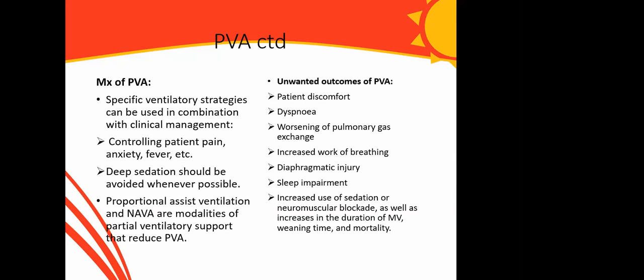and once you do that, because like we said, it could either be due to patient factor or ventilator factor. So if you deal with the patient factor, is the patient in pain, all right? Is the patient anxious? Is the patient feverish? Or is there any reason why this patient is auto-triggering or double triggering? You may want to find out, all right? And when you take care of patient's factor, you realize that you may not need too much sedation. In fact, it's been said, avoid deep sedation as much as possible.